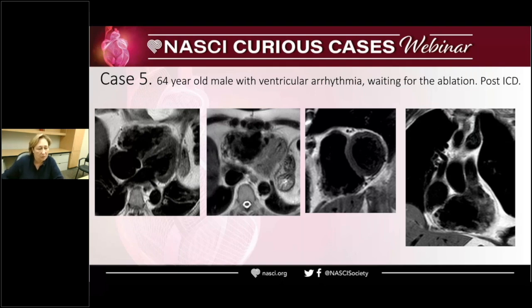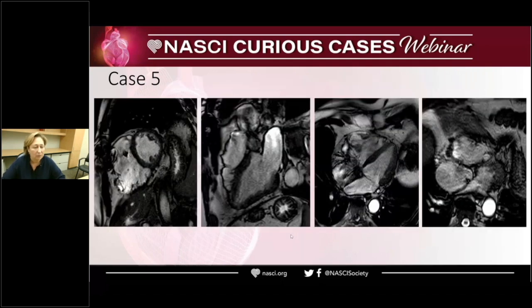We're looking at the right ventricle that has a very irregular border, with some outpouchings and small aneurysms along the entire free wall of the right ventricle. Not only that, it goes along the right ventricle and extends almost into the AV groove and then the apex. Those little outpouchings are like a little accordion everywhere.